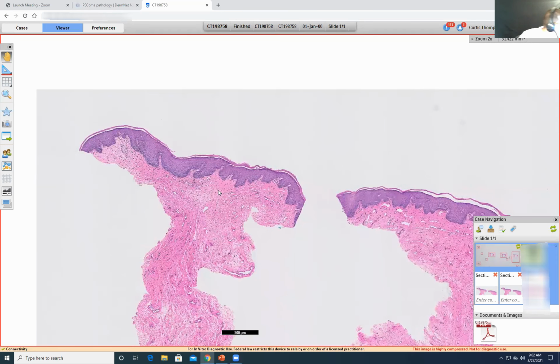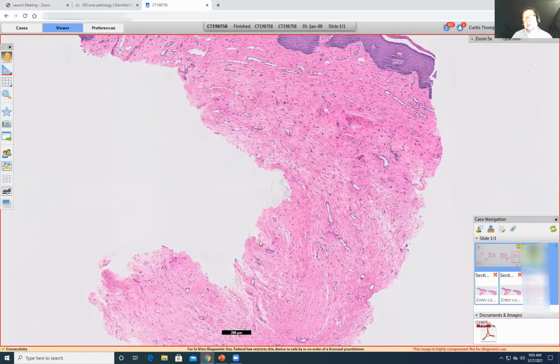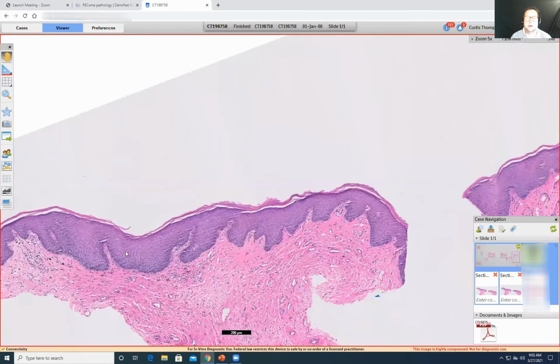So here we have a 43-year-old female, pigmented periurethral, so a genital pigmented lesion. You can see the punch. Typical in these punches from the genital region, they're often squeezed because they're difficult to obtain. Squeezing can happen anywhere from the person who does the biopsy, the person who puts it in the bottle, to the person who takes it out of the bottle, or even cutting the sections in the lab. But you need to look for it by being squared off. That's what the forceps do. It's not important in this case, but it often makes things look more atypical in the area where it's squeezed.